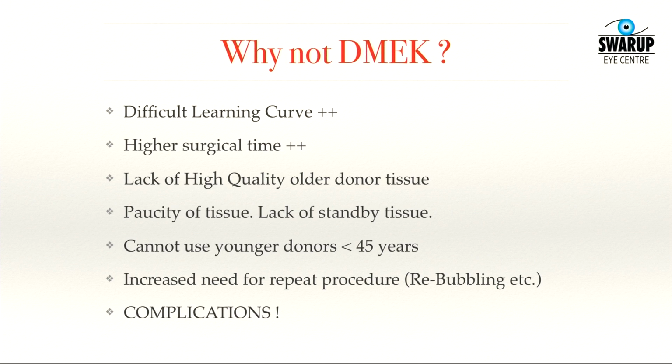So if you're a person whose surgical time is of paramount importance and you need to finish in a hurry, you'll always try to defer doing a DMEK. If you have an option to do a DSEK, you'll try to do DSEK. So that's what happens to all surgeons who move from DSEK to DMEK. DSEK is so quick, and once you've gone through the learning curve, it really doesn't take more than 10 minutes. So DMEK does take time, especially if you have a little bit of a problem.